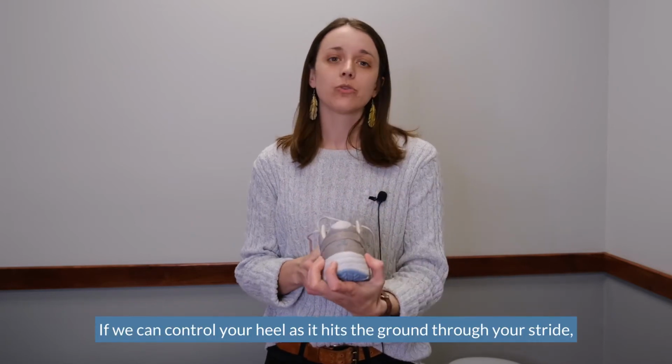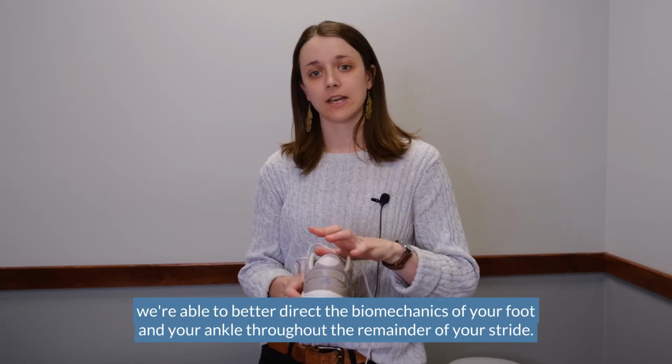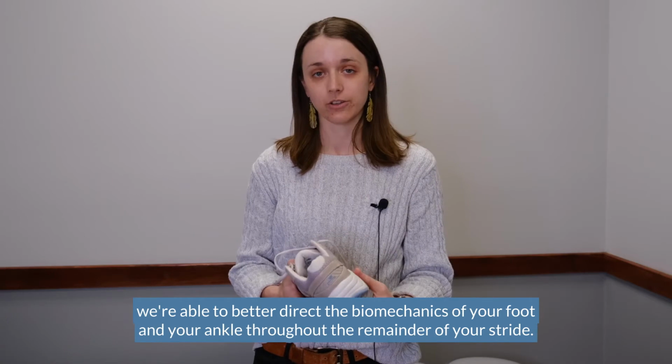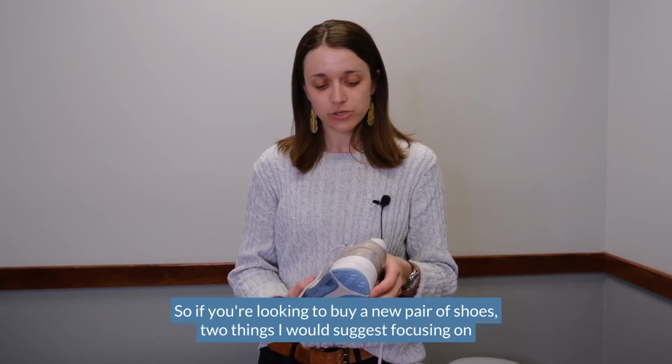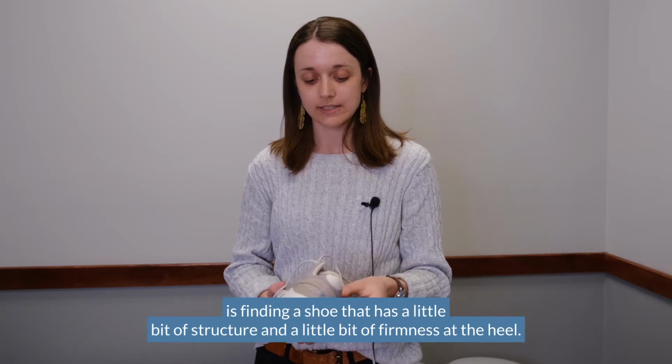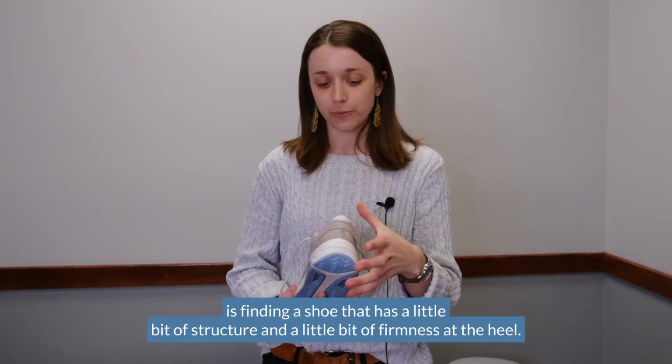If we can control your heel as it hits the ground through your stride, we're able to better direct the biomechanics of your foot and your ankle throughout the remainder of your stride. So if you're looking to buy a new pair of shoes, two things I would suggest focusing on is finding a shoe that has a little bit of structure and a little bit of firmness at the heel.